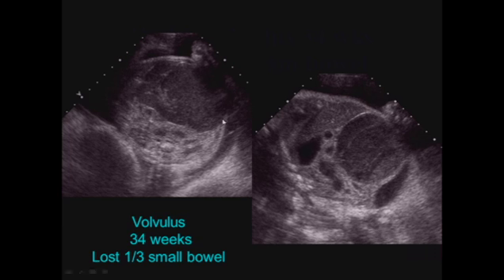Here's another patient with a bowel obstruction seen at 34 weeks, and we see this very large distended loop of bowel filled with these internal echoes, not peristalsing, just sitting and not moving. And if you look on the sagittal image, I think you can appreciate that we have multiple loops here that have twisted all around itself, and this did turn out to be a volvulus, and this bowel had infarcted, which explains the lack of peristalsis. This child lost about a third of his small bowel after delivery.